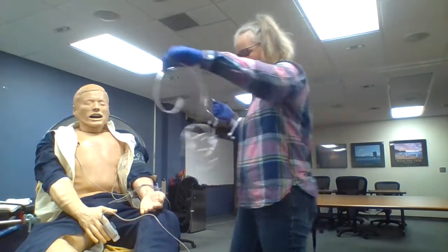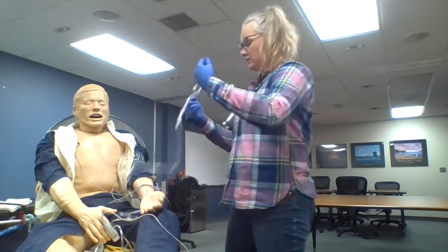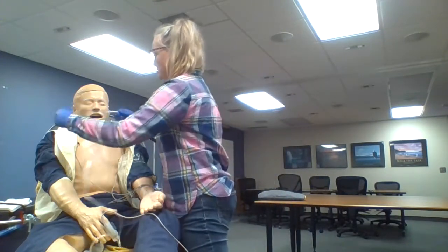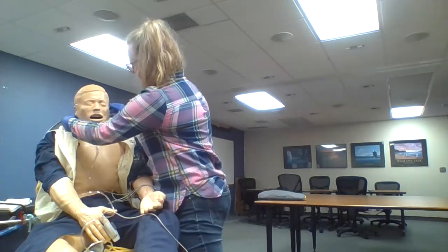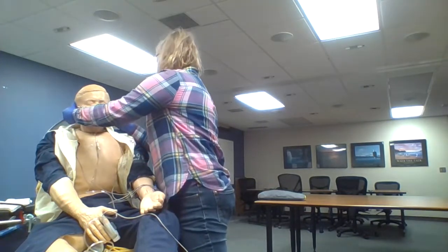Okay. So what I'm going to do right now, I see that your oxygen saturation is low. I'm going to put a little bit of oxygen in your nose here, okay? And that should help you. If you can try to take some nice breaths in through your nose, that would be great. And I'm just going to look you over a little bit further here, okay? Okay. So I'm just going to do a quick head to toe here.